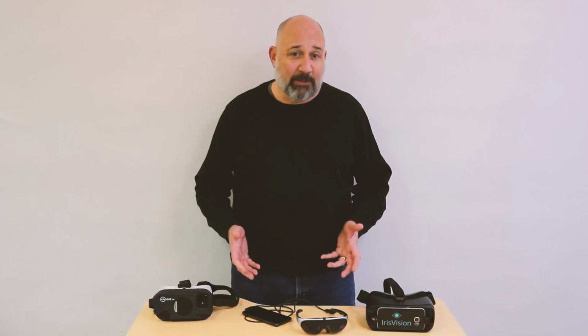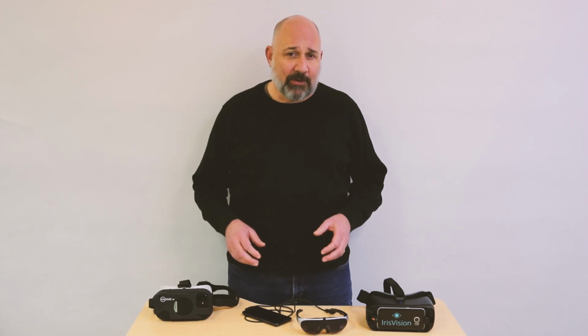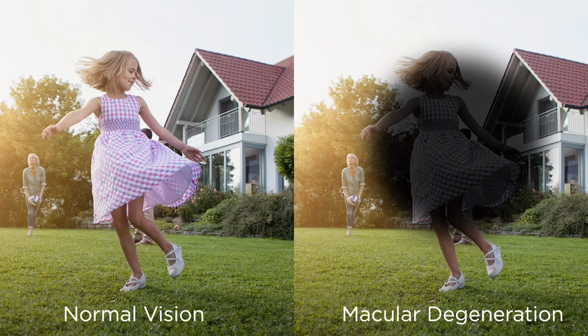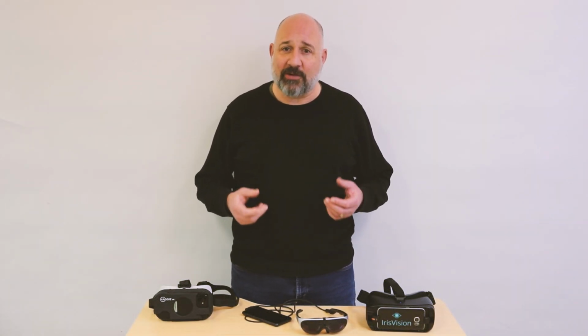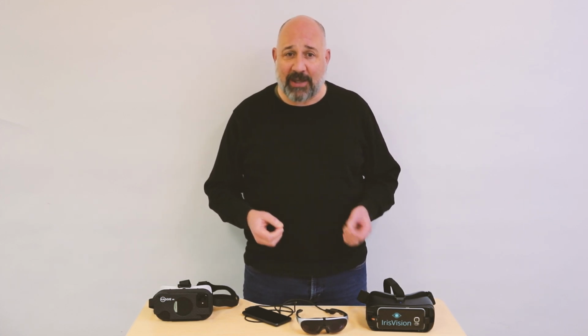The biggest group of people who contact us about these devices are people with macular degeneration. That's probably because it's the single biggest cause of vision loss later in life. Macular degeneration typically causes vision to deteriorate starting with the central vision and gradually working out. As that deterioration happens, you get less and less central vision until you're left with only some peripheral vision. When people are in the advanced stages of macular degeneration, this impairs their ability to see a screen that is presented directly in front of the eye, as with these virtual reality glass-based magnification systems.